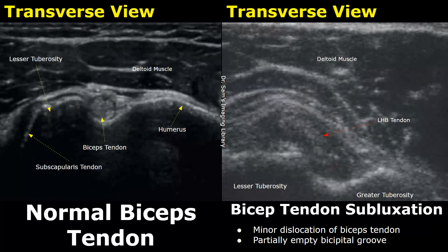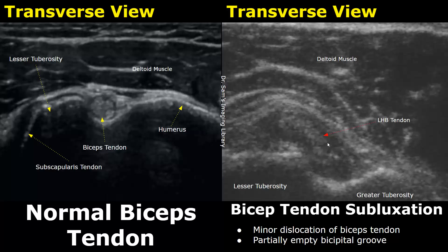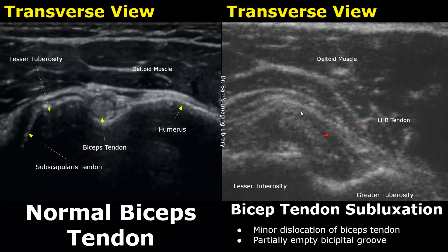Subluxation means partial dislocation, and in this case there is a biceps tendon subluxation — a minor dislocation of the biceps tendon. We may find a partially empty bicipital groove. This is the bicipital groove, and it is partially empty because of subluxation of the biceps tendon, which is slightly dislocated from its original location.